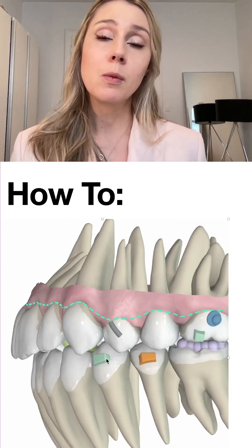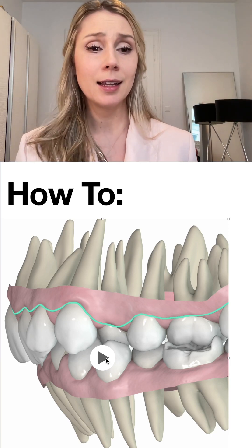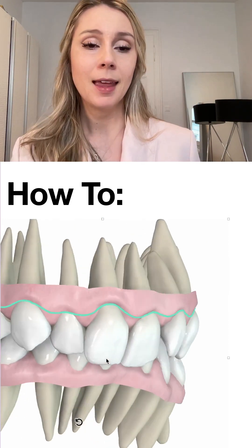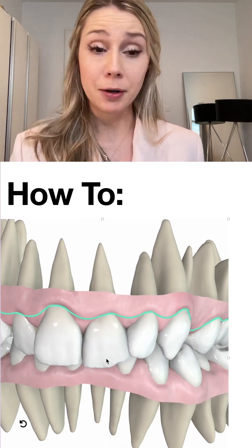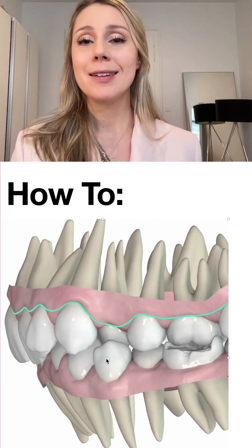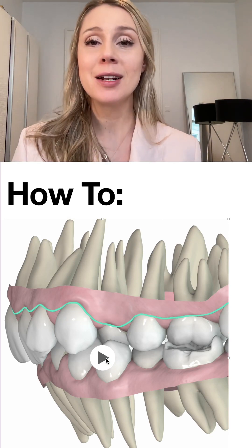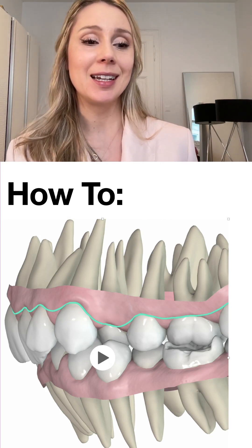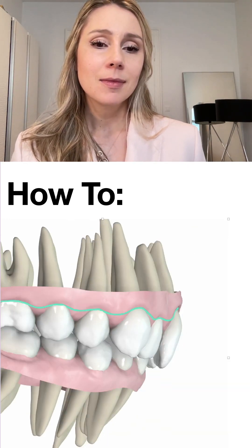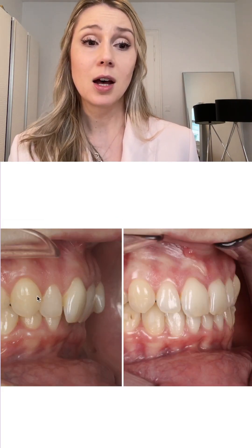If that patient had very small clinical crowns and very long roots, this movement would be extremely difficult — that's probably the only scenario where I would still use a retro-inclined pattern. But in a case like this, it's ideal to just apply lingual root torque from the beginning. Note also that this is an adult patient, so the bone is more mineralized with higher mineral content and more resistance — but it still worked out well.